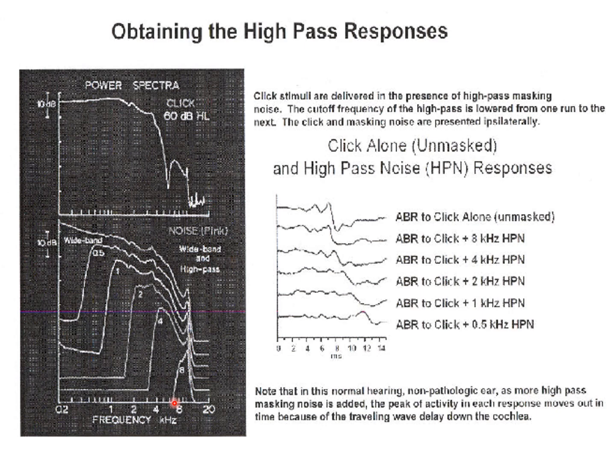And now when we decrease the cutoff frequency to 4000 Hz, then only this portion of high frequency components of the noise will pass. When we further decrease the cutoff frequency to 2000 Hz, then this portion of high frequency components of the noise will pass, and further decrease to 1000 Hz and then 0.5 thousand Hz. So these frequency spectra are the amplitude spectra for the high-pass noise at different cutoff frequencies.